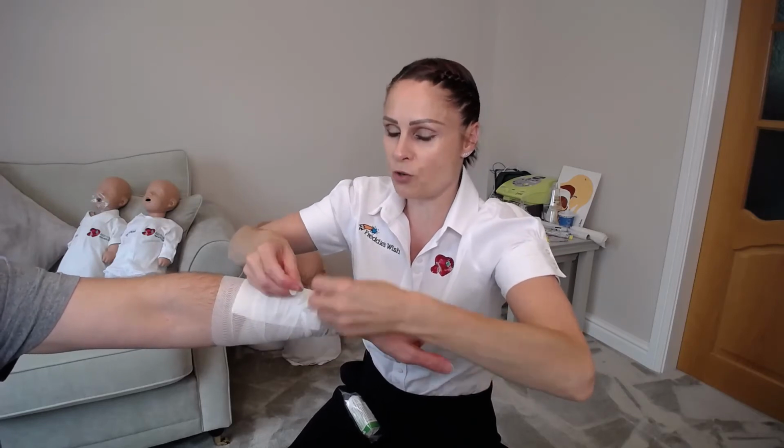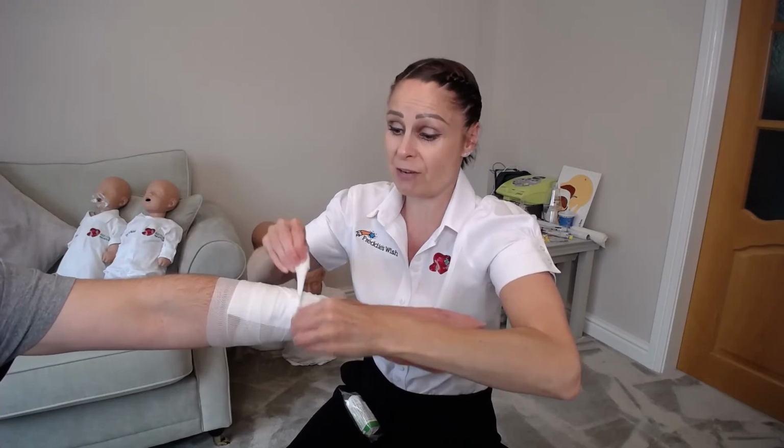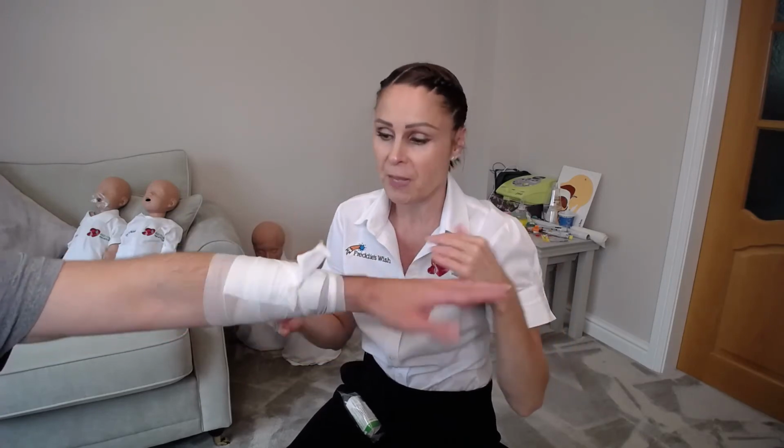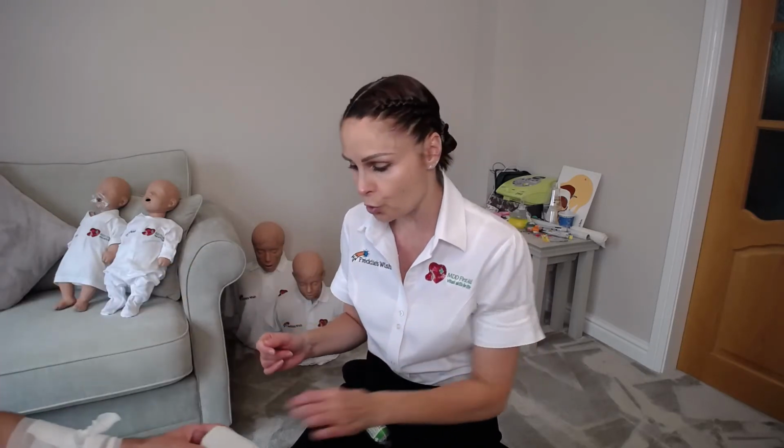So now you've got a firm dressing in position, and as I said before, this is not suitable for a serious bleed. You can't apply enough pressure. However, if this is all you've got, it's a million times better than nothing at all. So we're now going to move on to the trauma fix, which is your pressure dressing. So this is for severe bleeds.